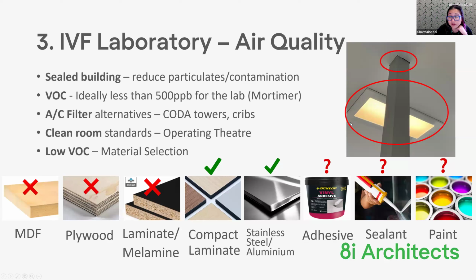Even things like light fittings. So you can see here, the light fitting actually should be sealed within the ceiling space. You can see here there's a bit of a gap between. You just run a bead of silicone around it.